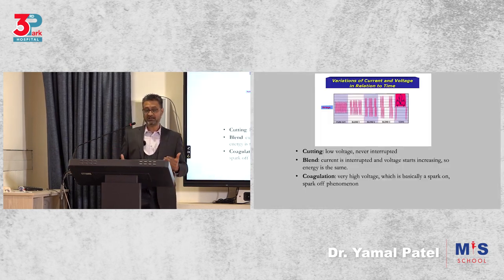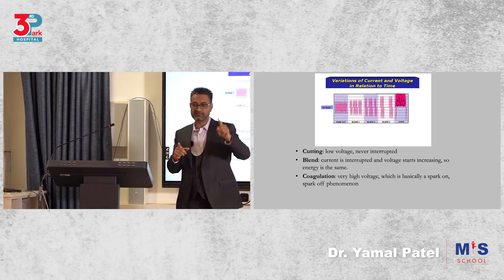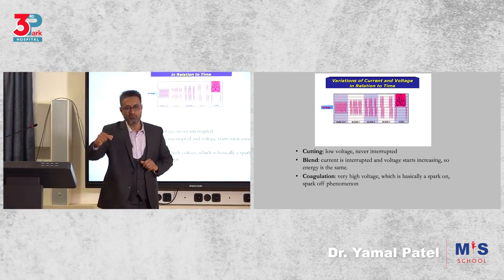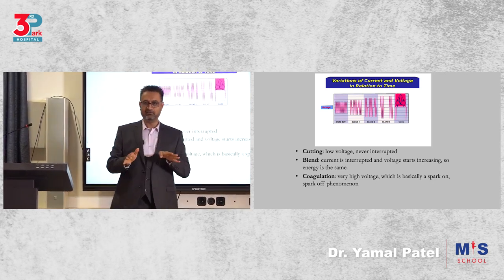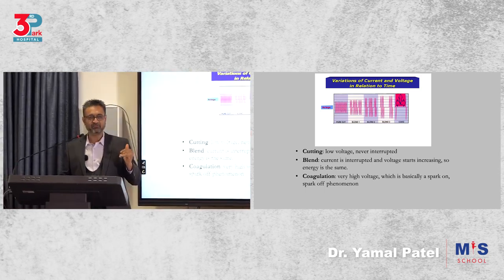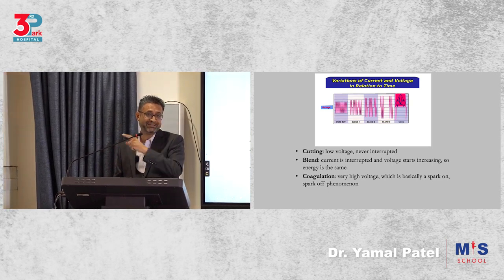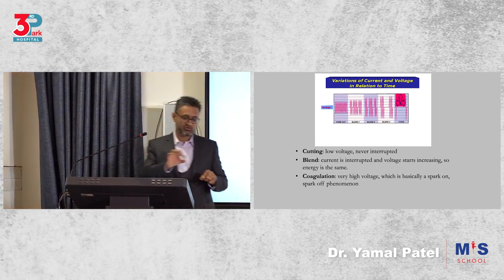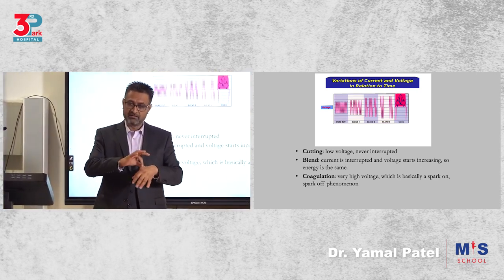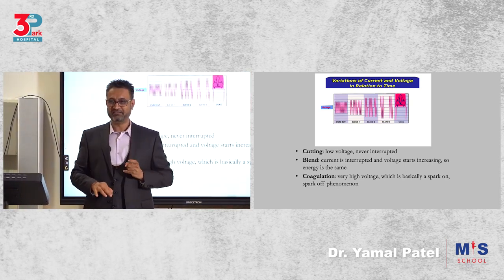So we should know about cut, blend, and coag. The mode. Please don't equate cut mode, or yellow, for cut, and coag mode, or blue, for coagulation. Wrong. Okay? You use the cut mode because it's a lower voltage mode, and therefore it is a safer mode. The coag mode is very, very, very dangerous if you don't know how to use it. So even in open surgery, when you're cutting and then you hold a vessel and you want to buzz it, you don't buzz it with the blue, you buzz it with the yellow.